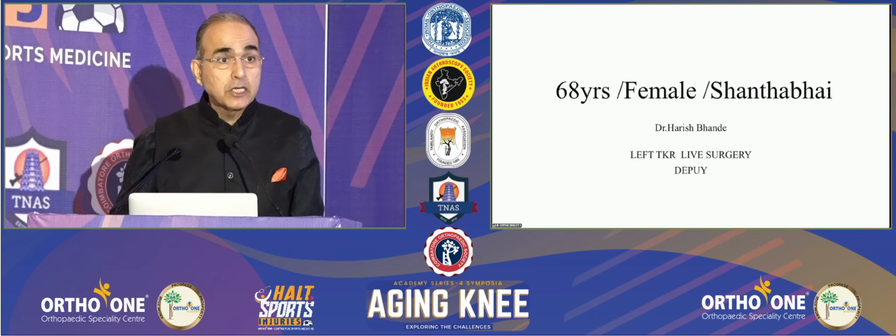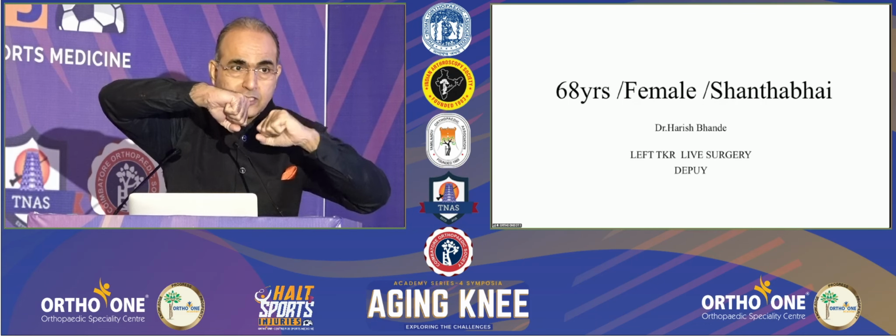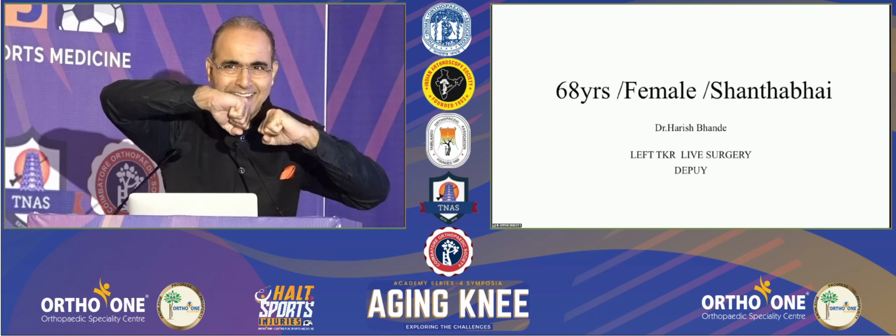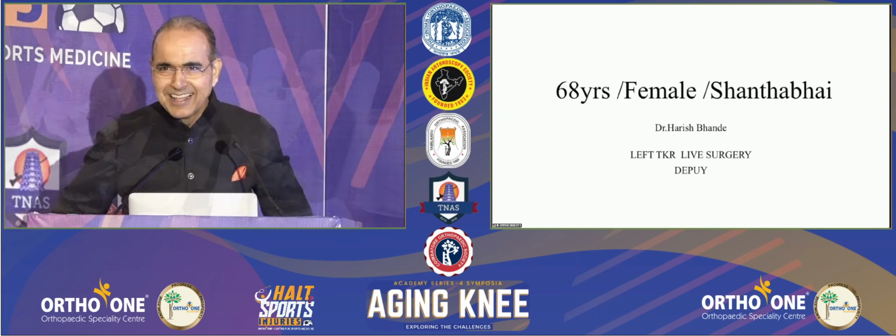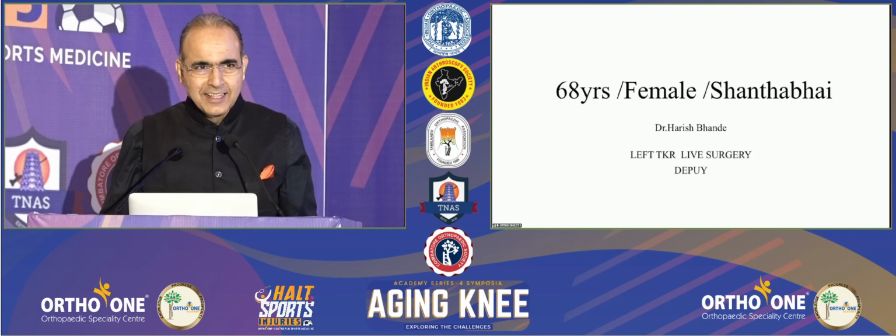Femur, right. But not in an effort to open up the medial space. That's not right. Because you're taking a varus cut on the tibia, so you cannot do that on the femur again. So it's going to open up the... No, just what I'm asking for. Opening the medial side, you tend to do sometimes.